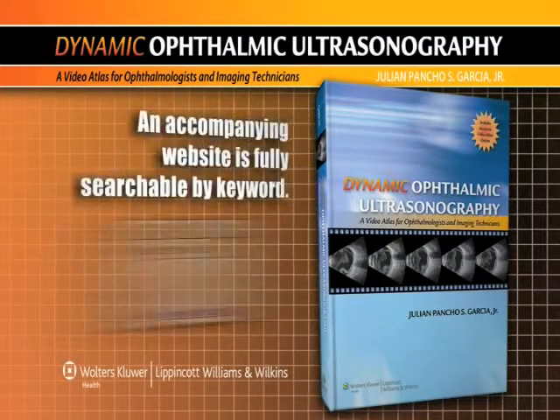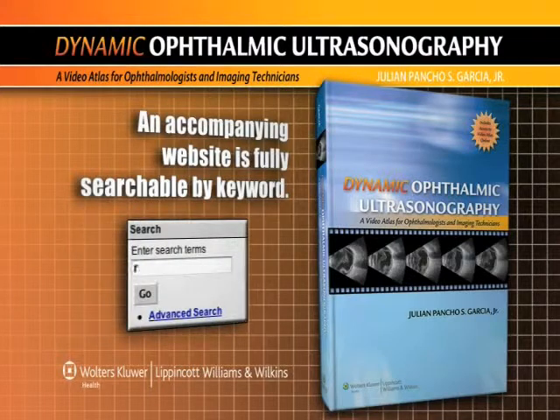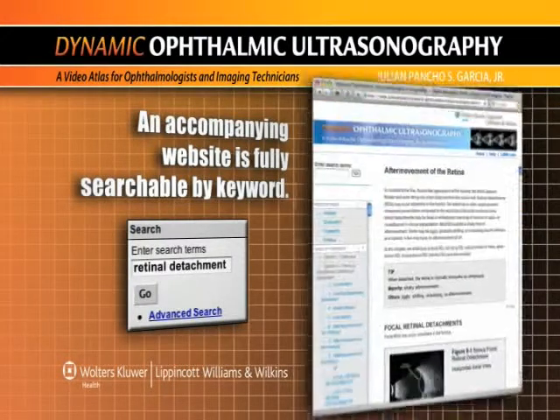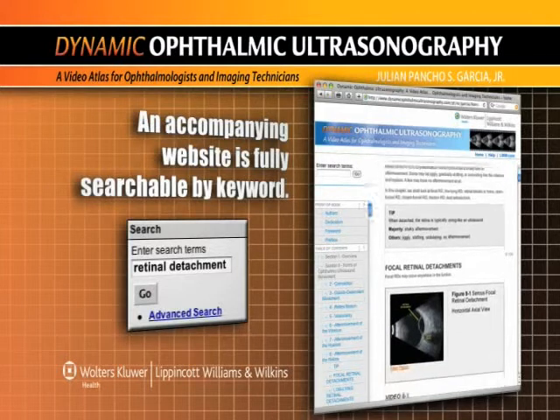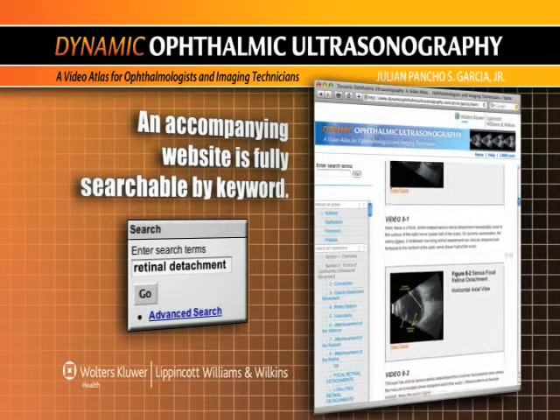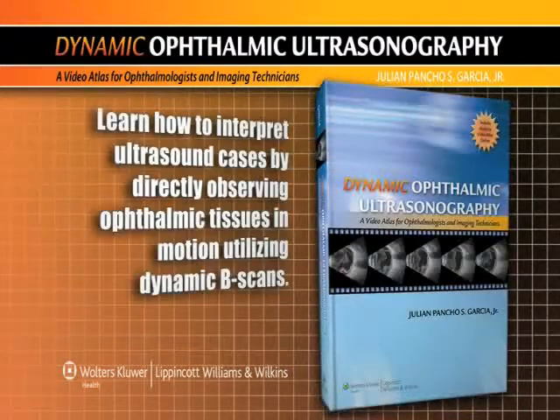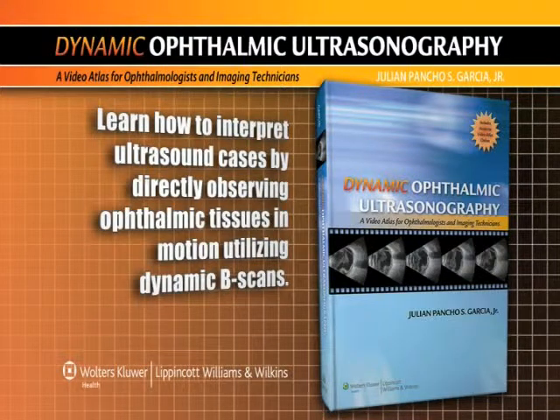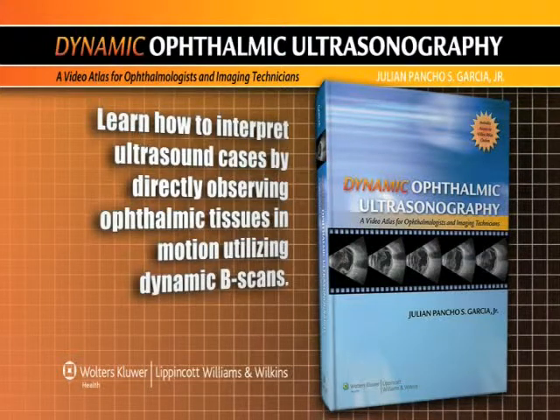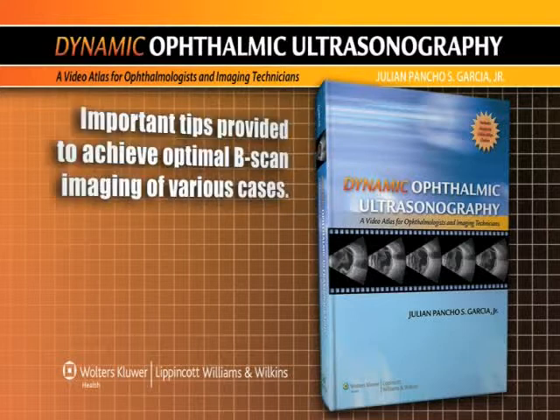Search the website for a differential diagnosis that matches your patient's ultrasound presentation using the index of keywords. Sharpen your clinical eye — learn how to interpret ultrasound cases by directly observing ophthalmic tissues in motion, utilizing dynamic B-scans.